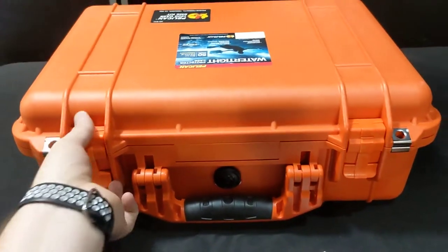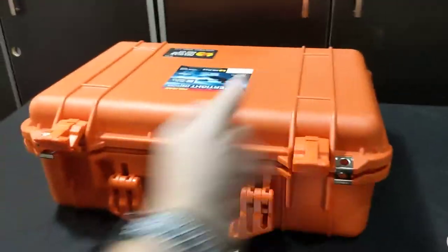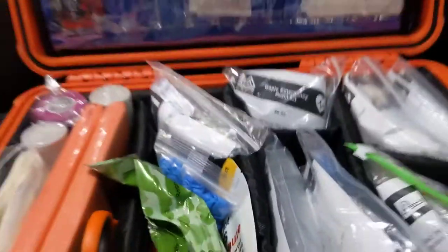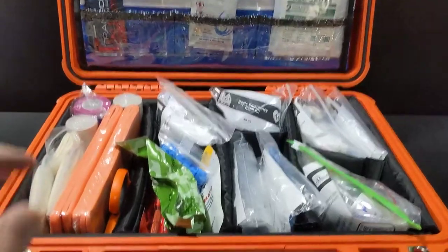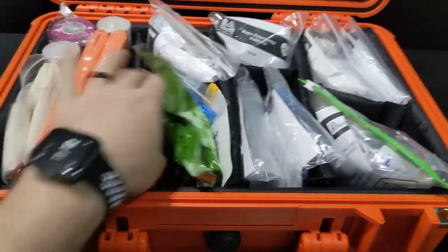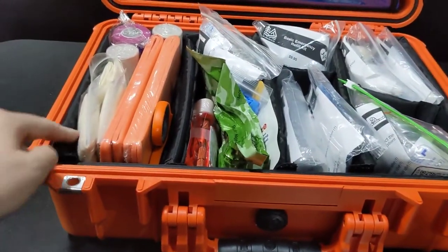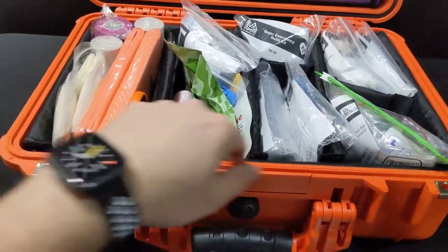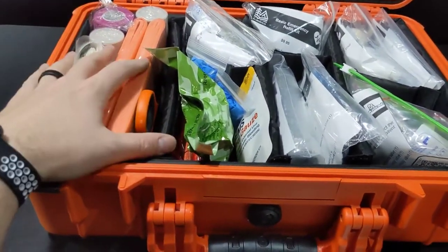It's got two latches that are easy to undo one-handed — you simply pull up and your kit opens. Inside the bottom, you have movable Velcro dividers that you can adjust however you like. They also come with padding around the bottom and sides, which really helps protect any products from a drop or fall.